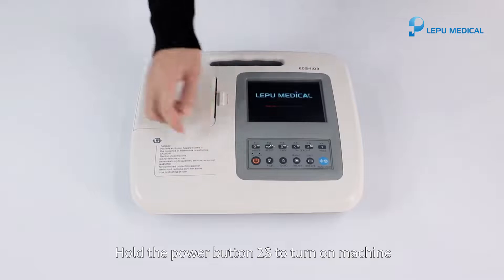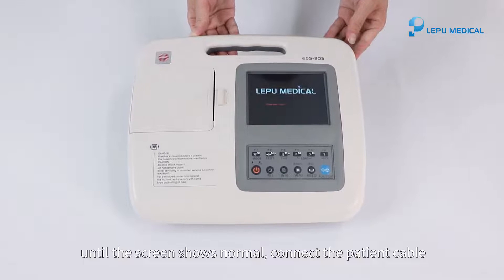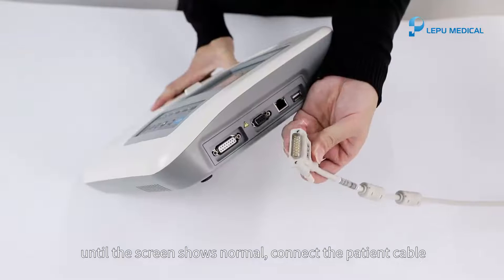Hold the power button for two seconds to turn on the machine until the screen shows normal. Then connect the patient cable.